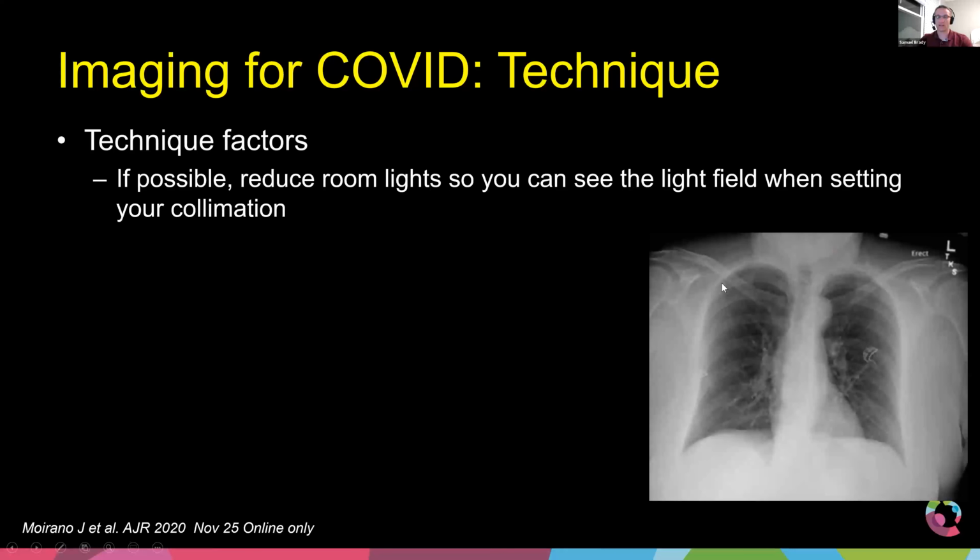The other thing to talk about is being able to set the field of view. So we just talked about getting the right collimation, right?